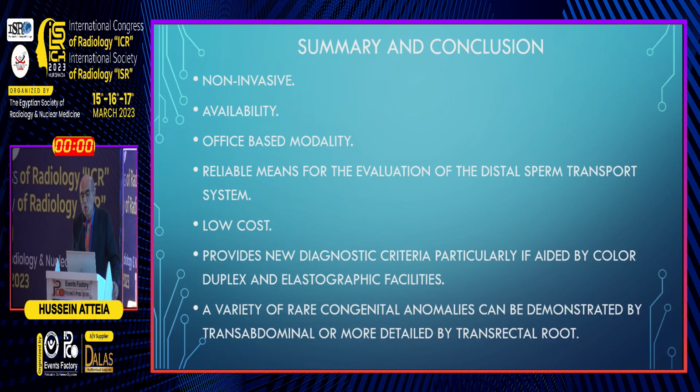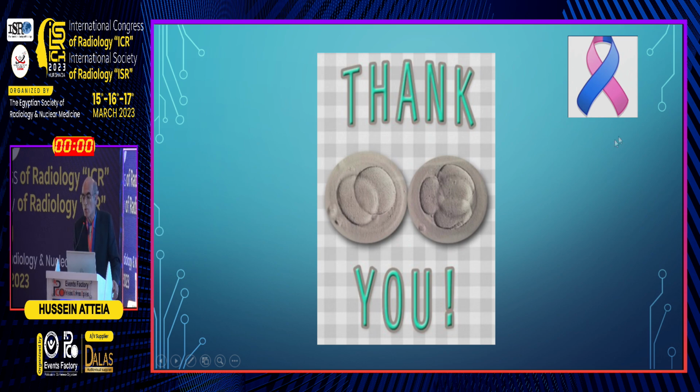Finally, summary and conclusion. It's a non-invasive, available, office-based modality, a reliable means for the evaluation of the distal sperm transport system. It's low cost and provides new diagnostic criteria in the presence of color Doppler and elastography. A variety of rare congenital anomalies could be seen by transrectal ultrasound. Thank you very much. Always remember that to tango, you must have both male and female checked up.